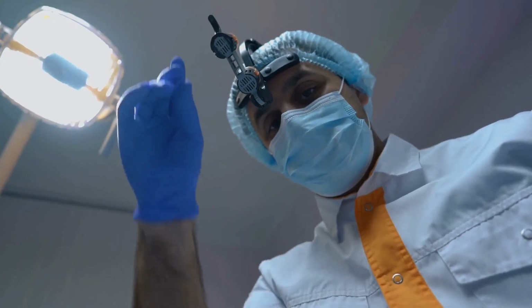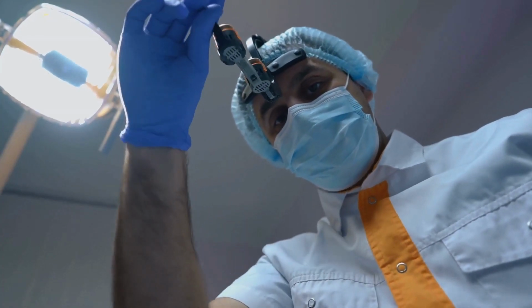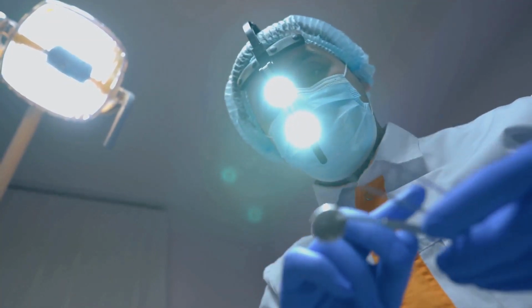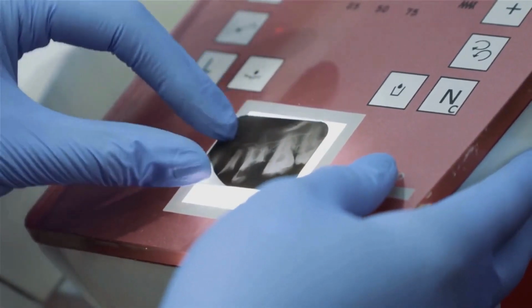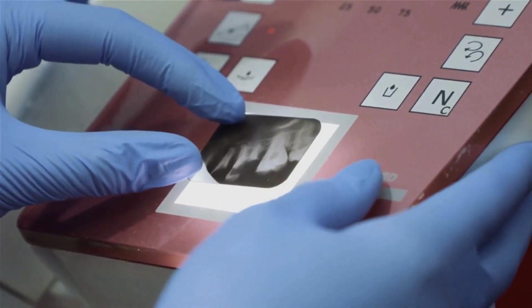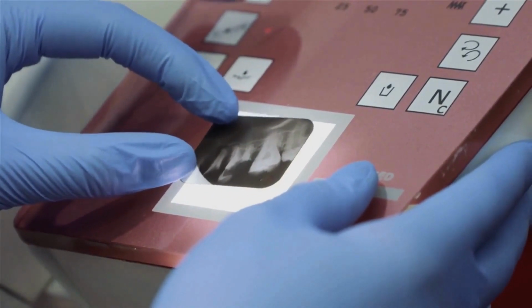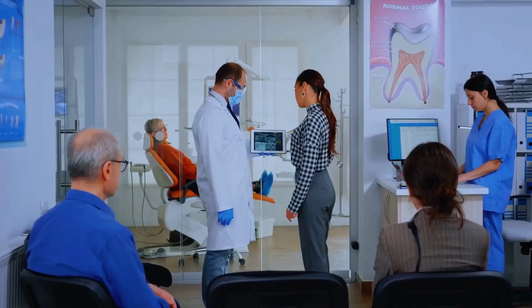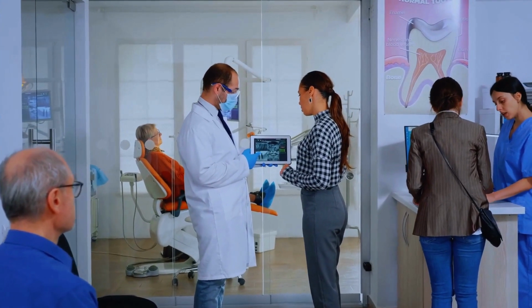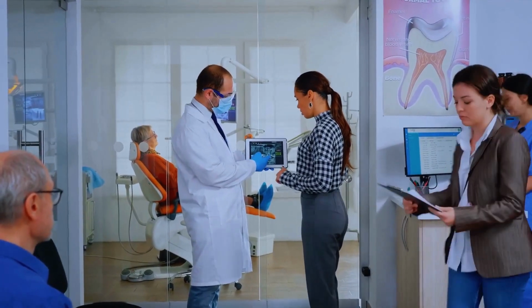This glare not only affects the aesthetic quality of the photographs, but can also mask subtle details crucial for accurate diagnosis. For instance, detecting early signs of decay, hairline fractures, or subtle changes in tissue texture can be difficult under normal lighting conditions. Cross-polarized photography addresses this issue by utilizing two polarizing filters, one placed over the light source and the other over the camera lens.